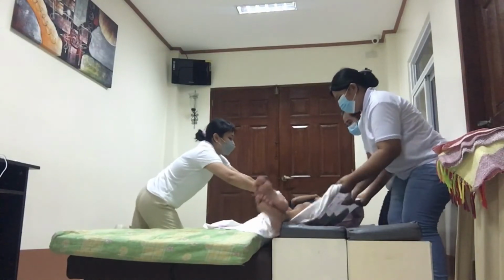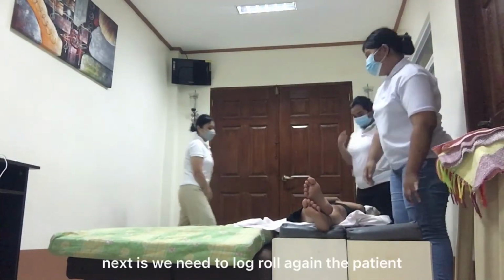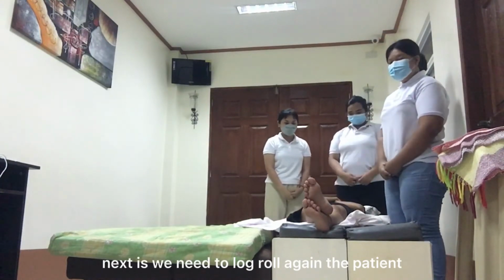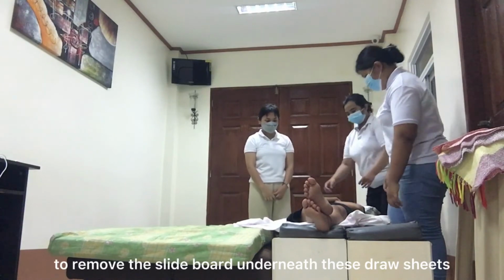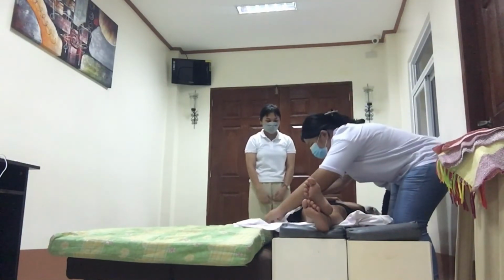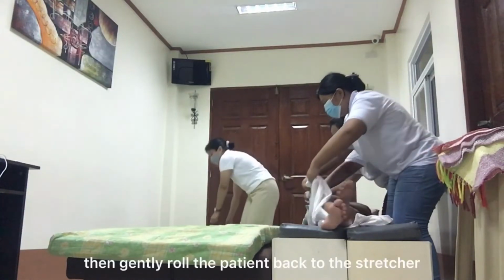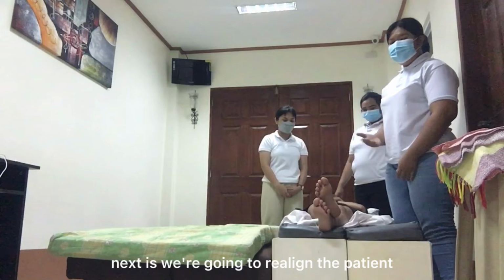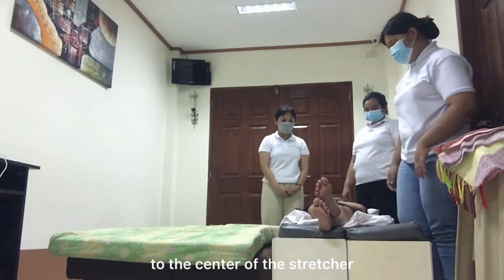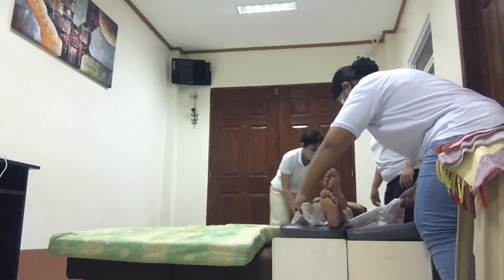1, 2, 3. Okay, so next we need to log roll the patient again to remove the slide board underneath the draw sheet. 1, 2, 3. Then gently roll the patient back to the stretcher. Next, we're going to realign the patient to the center of the stretcher. Okay, ma'am, realign.